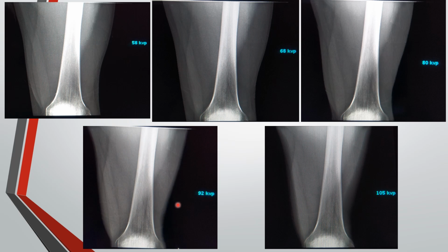Whereas as we increase, now we're losing some of this detail here, okay? It's penetrating. There's too much transmission occurring in these parts. And then here it's much more just white. We lose some of the detail that we had on these lower kVps, and this is penetrated far too much now. So there's way too much transmission going on in here as the kVp rises. Okay, so this is an example of how the kVp can change the look of the image, even with the imaging software.